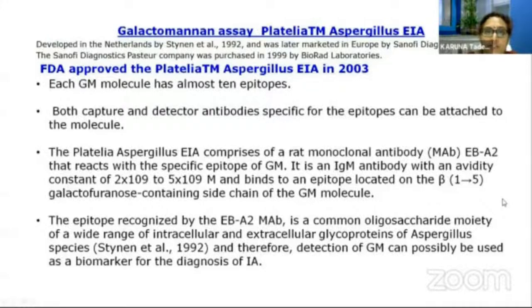So today we will be demonstrating to you the galactomannan assay, the Platelia-based technique, and the Fungitell assay, that is the beta-D-glucan assay. The kit that we are using is Fungitell. So both the tests will be demonstrated on video.